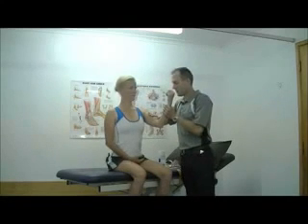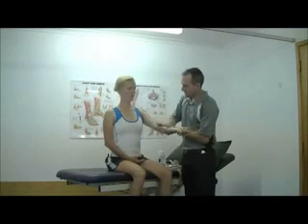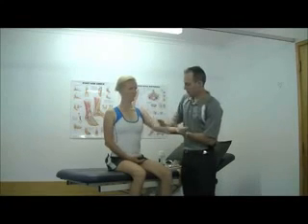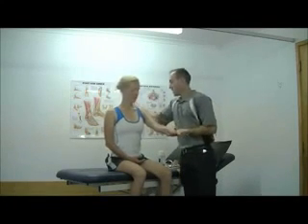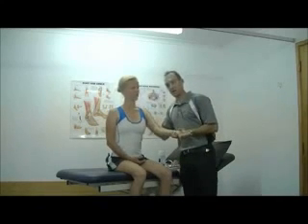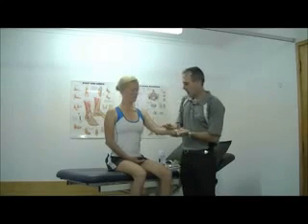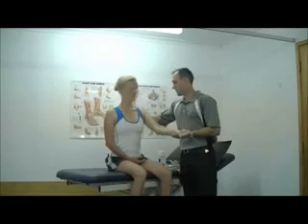Now, as I mentioned, it's a heat-sensitive glue as well, so if we straighten out, give it a good scrub, you'll find that you get much better adhesion. If you get a good adhesion in the first place, you'll find that this tape lasts 5 days, no problem at all. Okay, with showering and things, that's perfectly okay.